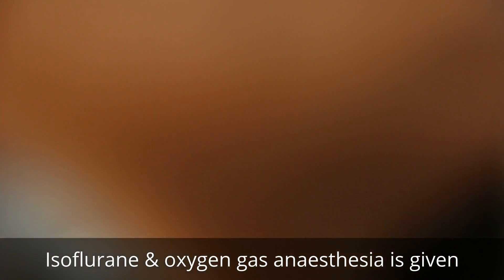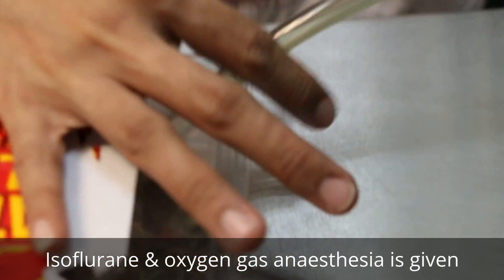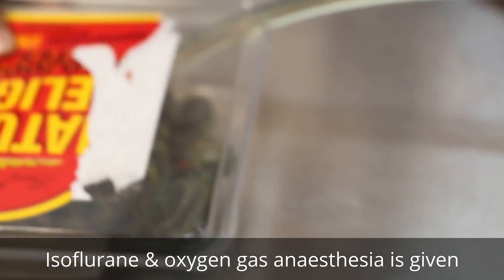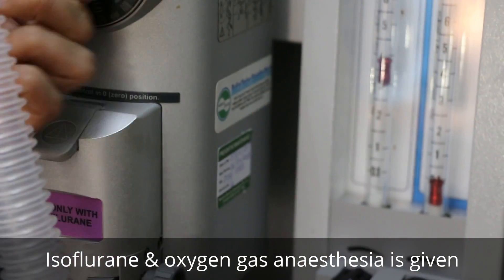Now put it under gas - put it in the box there and give some isoflurane gas so that it won't move too much. What I do is a purse-string suture on the anus - about 14 days normally we keep it - not too tight and not too loose.